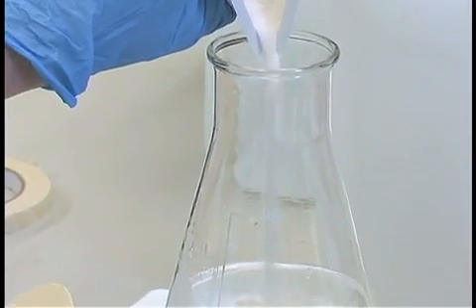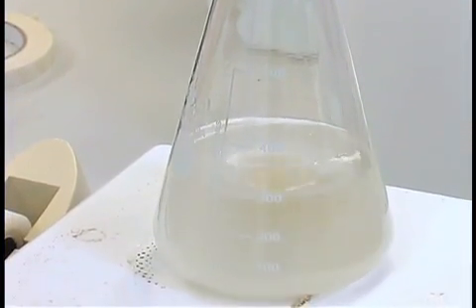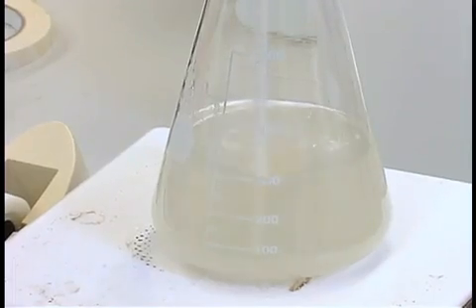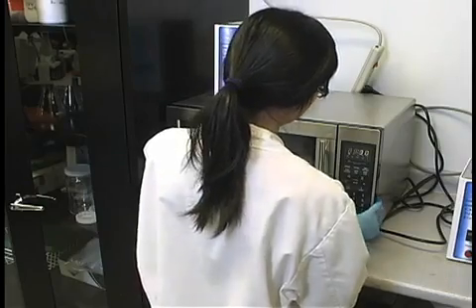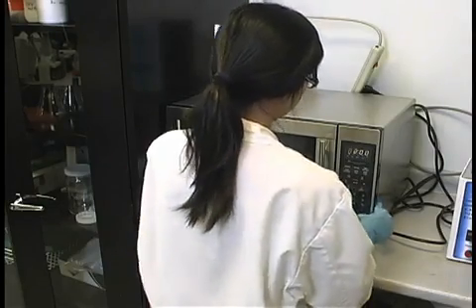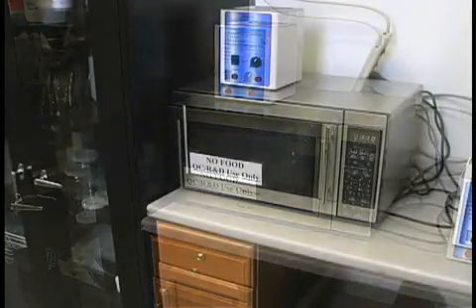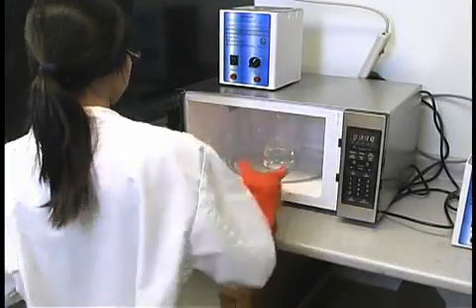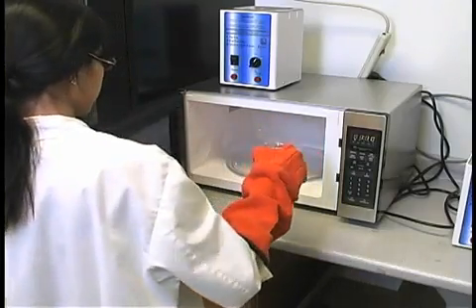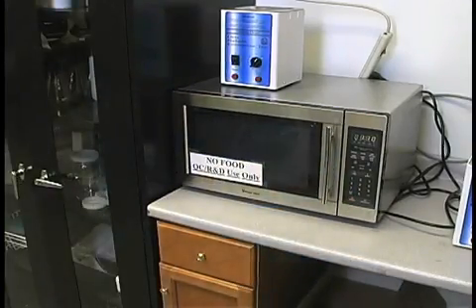If a gelling agent such as agar or gellan gum is used, you should add the components at this time. These compounds will not completely dissolve until heated. An alternative technique is to dissolve and heat the gelling agent in the remaining 20% of tissue culture grade water that has yet to be added to your batch production container. This solution can be heated until the gelling agent is completely dissolved on a hot plate, microwave, or in the autoclave. Be sure to use autoclave gloves or other protection when removing hot liquids from the microwave.